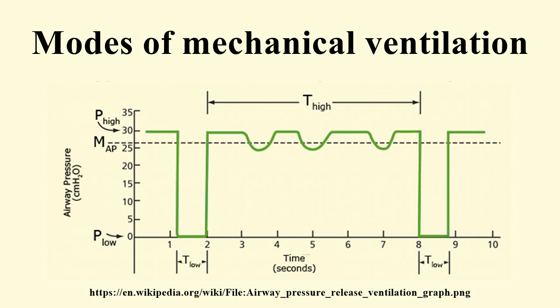Volume guarantee. Volume guarantee is an additional parameter available in many types of ventilators that allows the ventilator to change its inspiratory pressure setting to achieve a minimum tidal volume. This is utilized most often in neonatal patients who need a pressure-controlled mode with a consideration for volume control to minimize volume trauma. Spontaneous breathing and support settings.